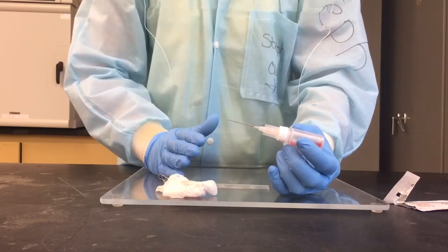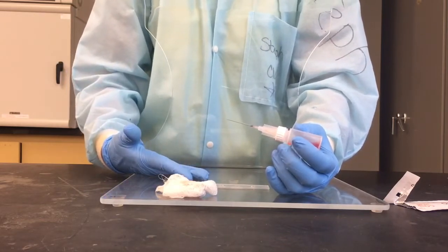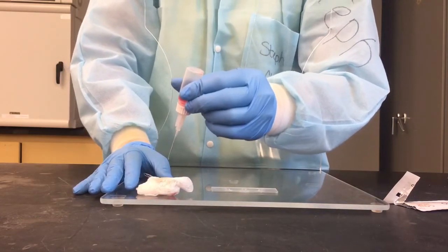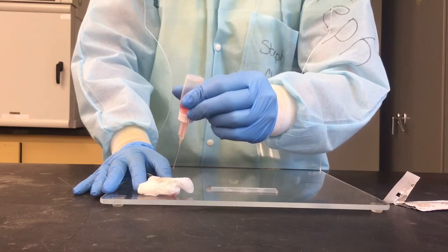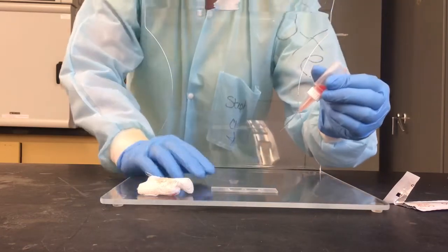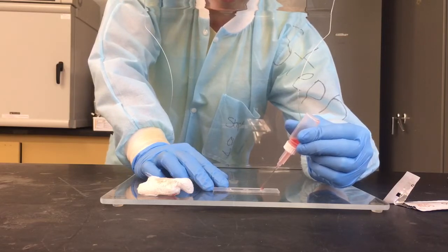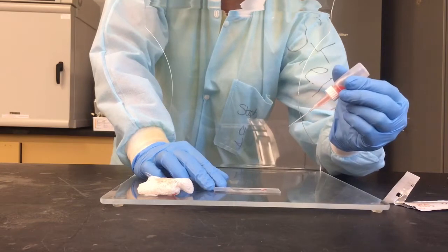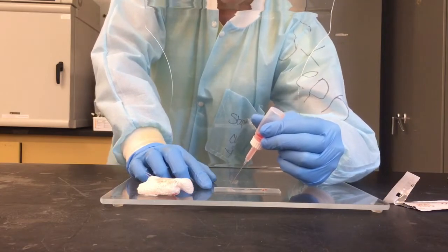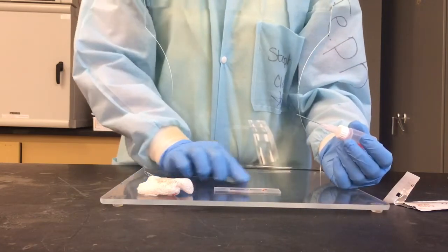You also want to give yourself a little bit of time to practice it and get used to the volume and the speed at which these drops come so that you can load your hemocytometer successfully. So what I recommend is just flipping it upside down and giving it a little bit of gentle pressure, and then drop, I don't know, 3, 4 drops or so out until you're kind of used to what it's like. And then when you feel like you're ready, get a nice free falling drop, hang it right over the top of that half moon shape, and you'll be able to watch the liquid imbibe down each one of these reservoir channels. So when I do it over side B, you'll see it imbibe all the way down.